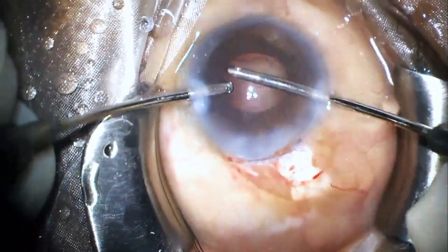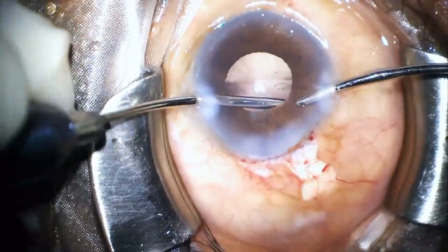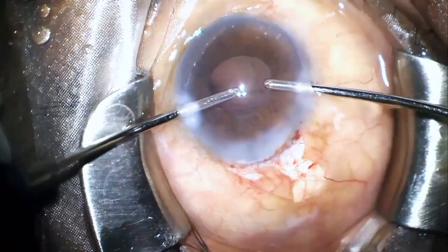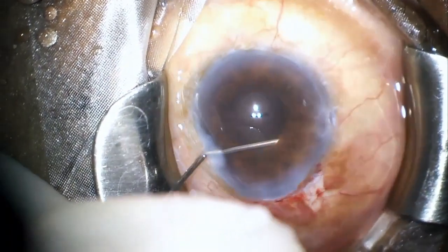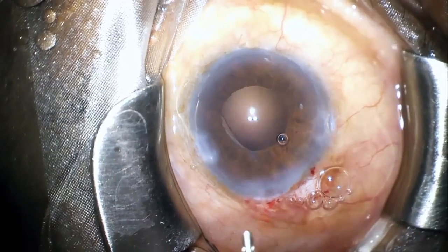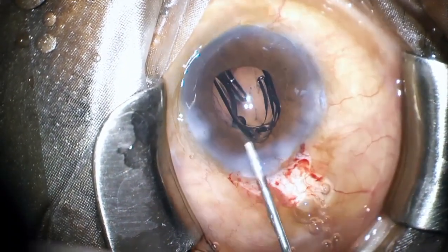At this point I was also thinking of using iris hooks or a pupil expansion device, which would surely have helped me approach the fragment in a better and less traumatic way. However, I reserved this option as a last resort, and since I was sure there was no posterior capsule rupture or vitreous and the bulge was still visible under the iris, I went ahead with implantation of a single-piece hydrophobic monofocal IOL in the bag, which was planned for this patient.